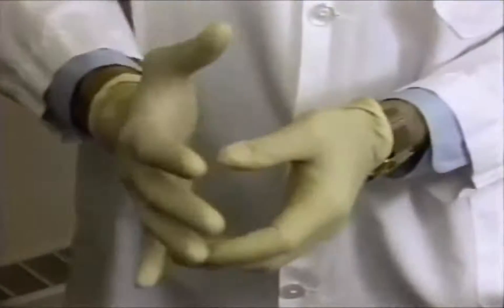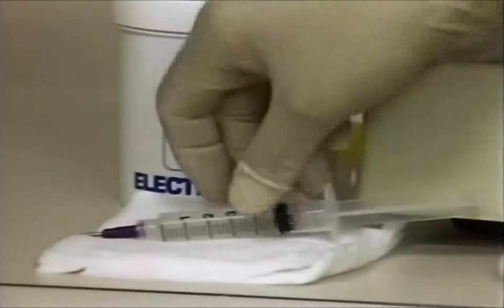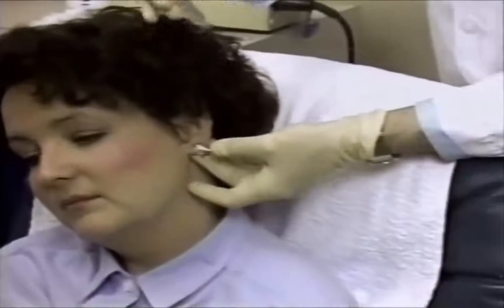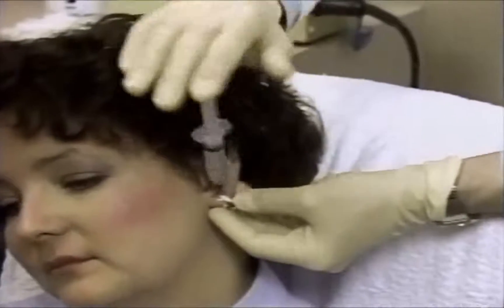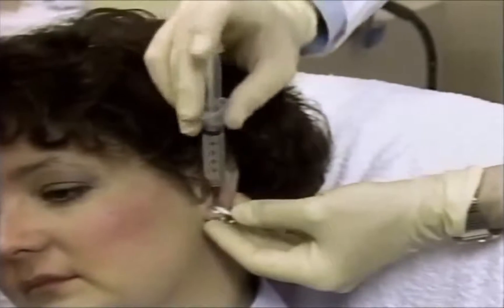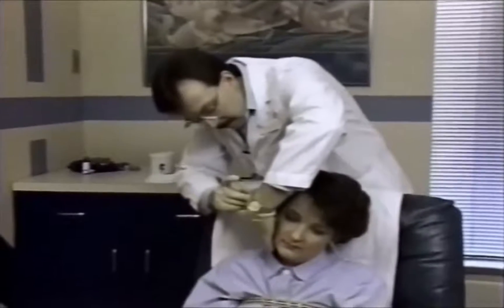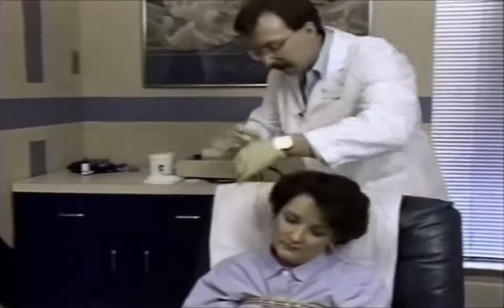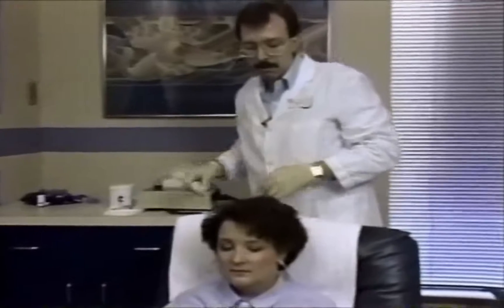Using the syringe plunger, inject a small amount of electrogel into the disc cavity. Holding the syringe with the dominant index finger and opposite four fingers to hold the electrode down, rock the syringe back and forth using moderate pressure. This will abrade the skin and reduce electrode resistance. Follow the same procedure with the opposite ear.